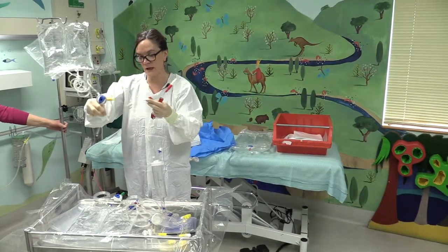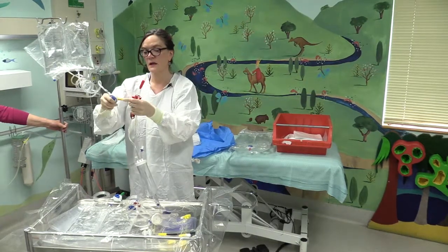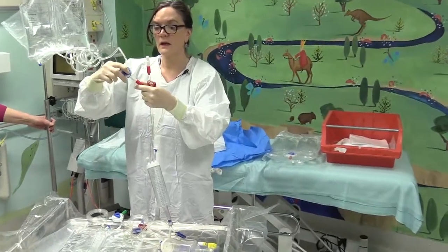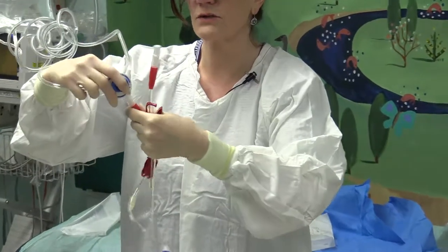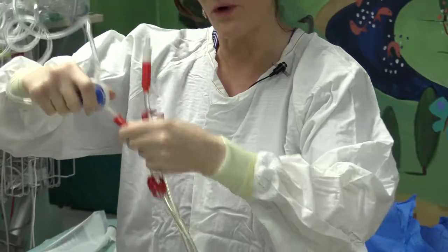So removing the white cap, just drop it onto the clean surface, take off the yellow cap, and it's a luer lock, so we just tighten it into position. So make sure that that is twisted so that it's tight and won't pull apart.